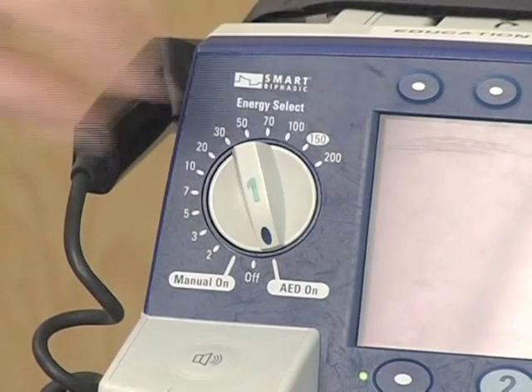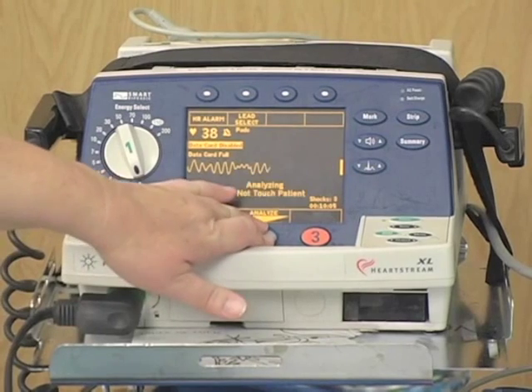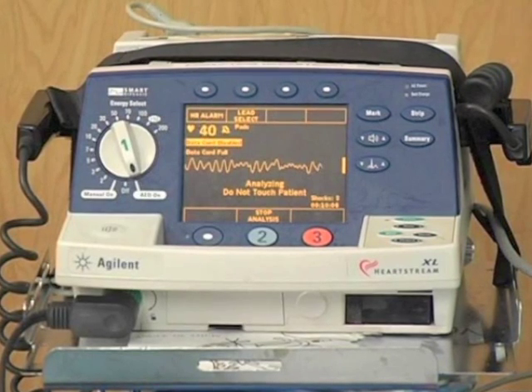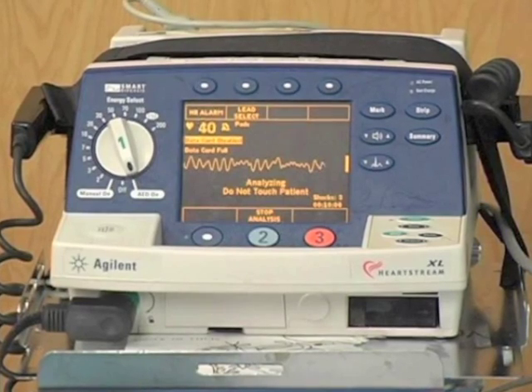Turn the knob on the AED to AED on and press the button under Analyze. The AED will analyze the patient's rhythm and instruct staff not to touch the patient. Analyzing. Do not touch patient.